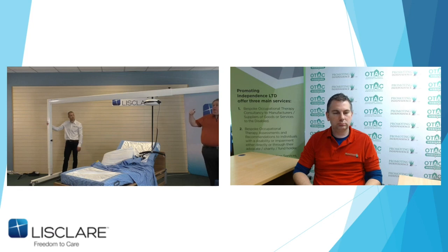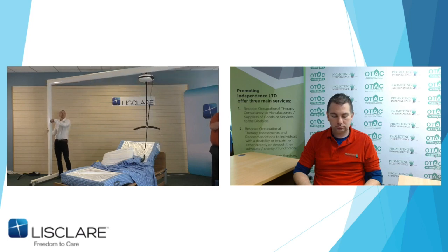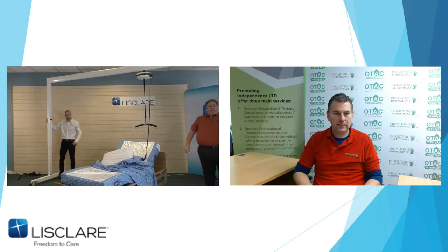Now, I thought the 3 to 4 metre would be more popular. It turns out it's actually the 2 to 3, because most houses that I've been working with are garages that have been adapted into a bedroom usually. And that means, one second, here we go, up we go. You can hear the click, so it's all the way down.